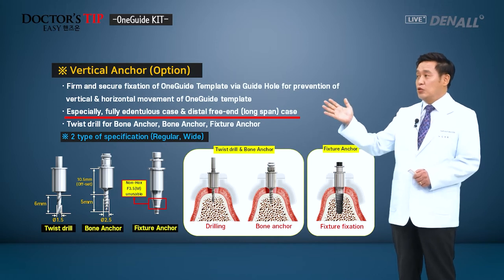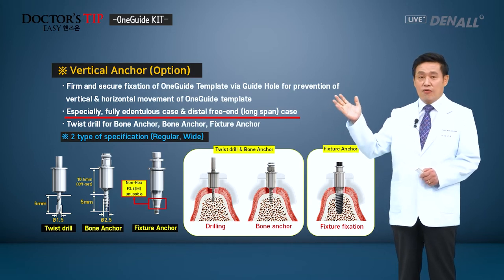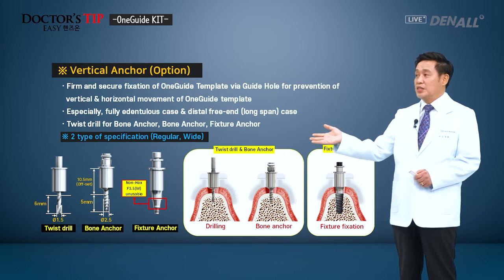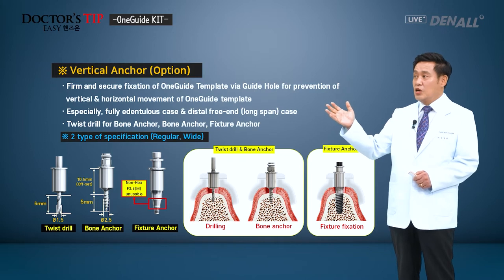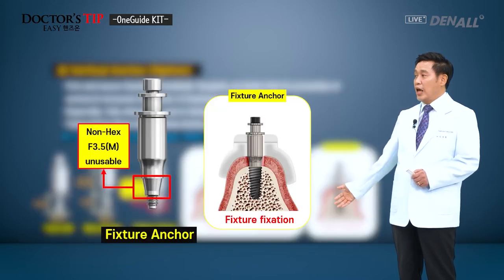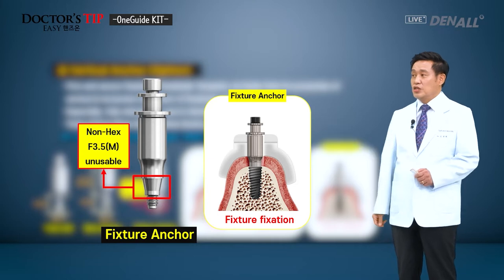Especially for fully edentulous cases, and if there is a long span free end distally, you can position the template more firmly and use it. If you use the vertical anchor, and as you've seen before, if you use the lateral anchor system, you'd be able to position the surgical template accurately. And after removing the bone anchor system, you place the fixture, and after that, you can connect it like this. Using the fixture, you can get vertical anchorage and fixate it.